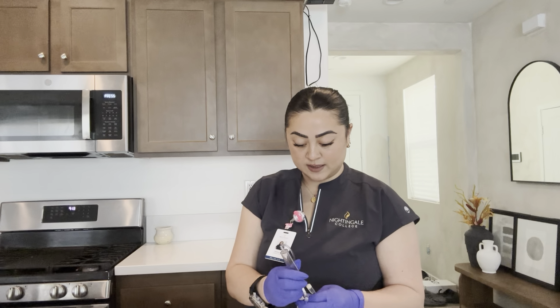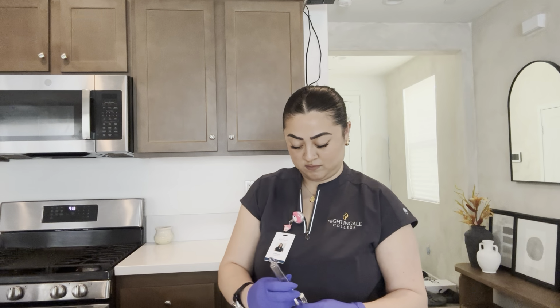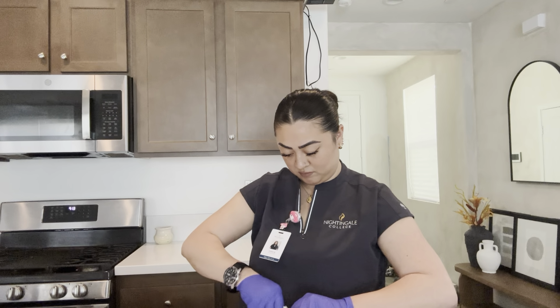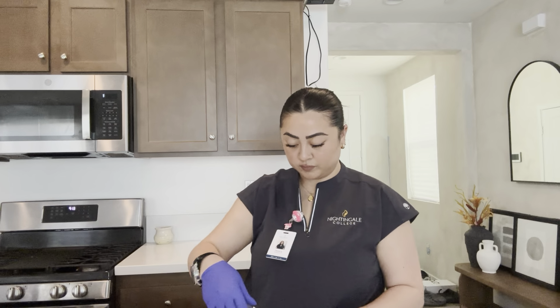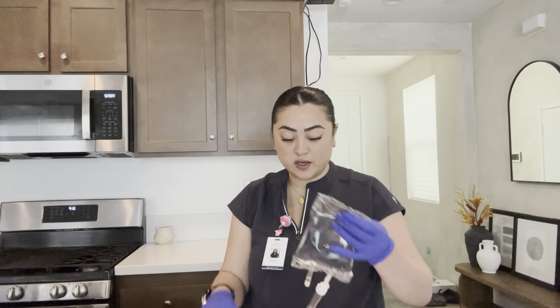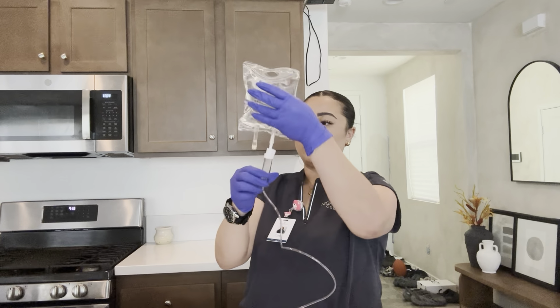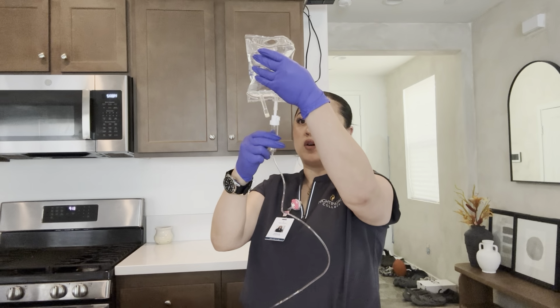I'm gonna place that spike in. And I do have everything clamped as of right now. We just want to fill it about either halfway or a quarter.